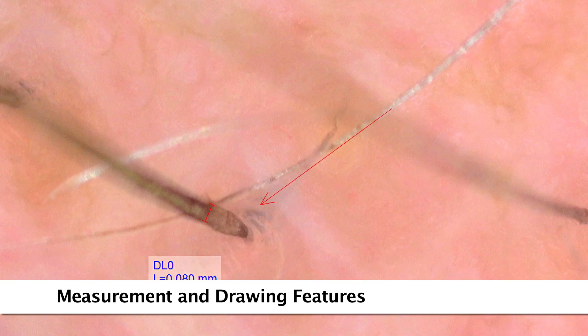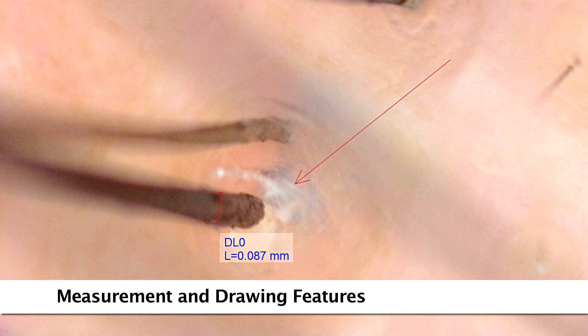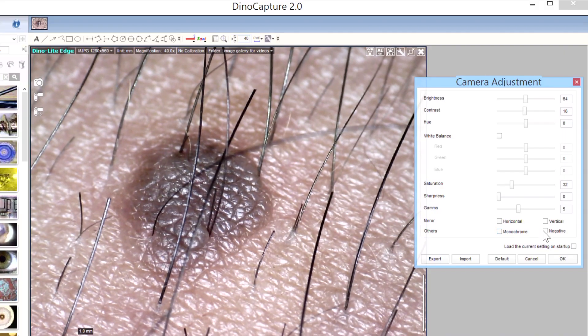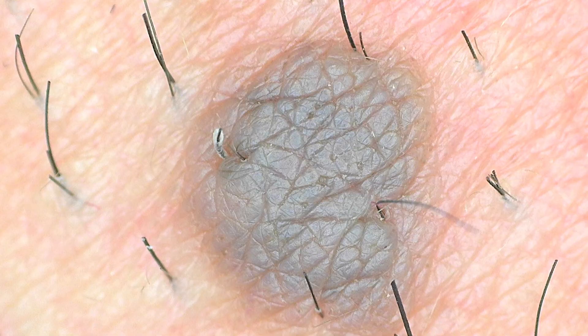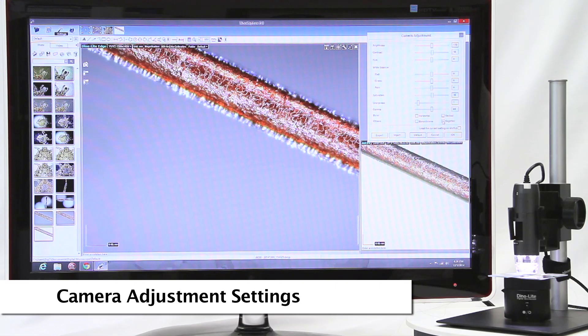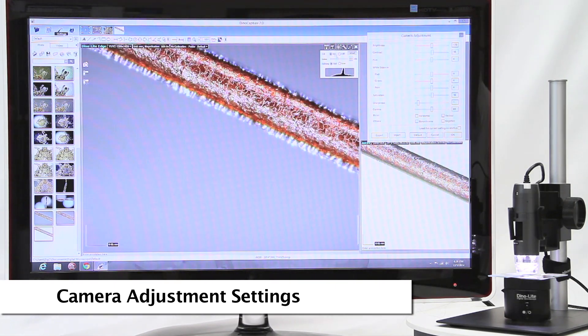The DynoCapture software also has measurement tools for compatible measurement models, as well as other drawing and text tools that can be used to label images and annotations. Software adjustable camera options include negative and monochrome modes, options for white balance, exposure settings, and more.